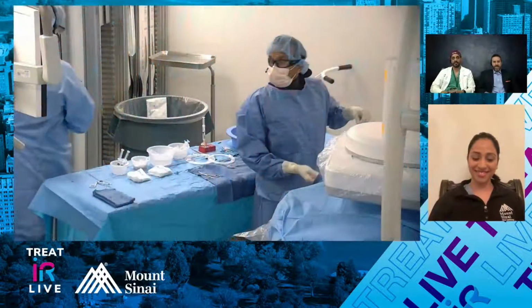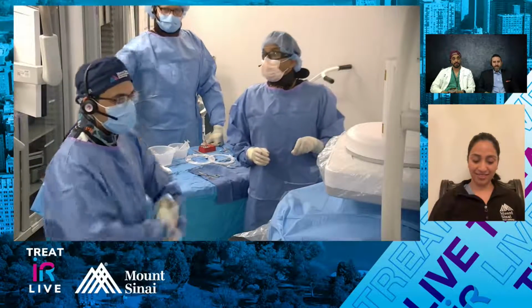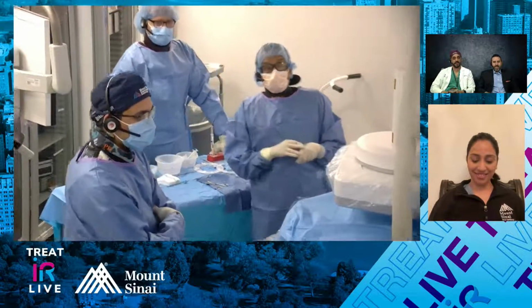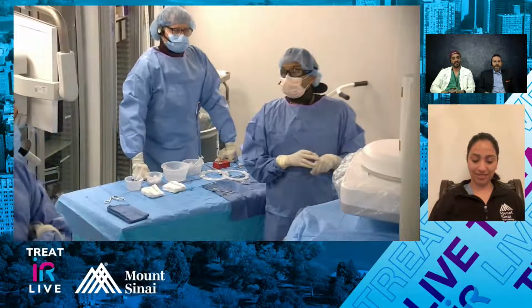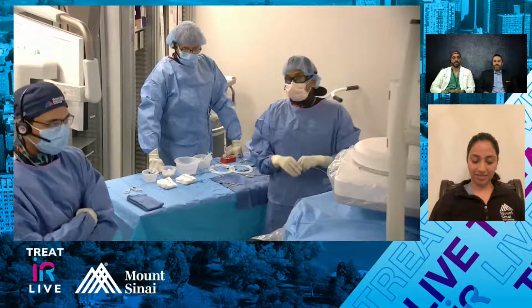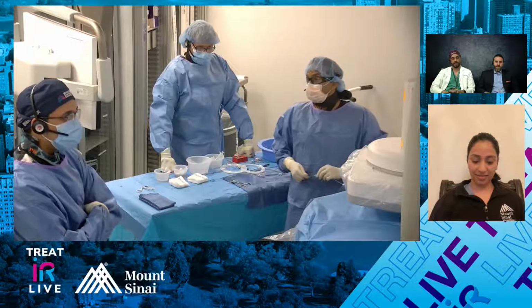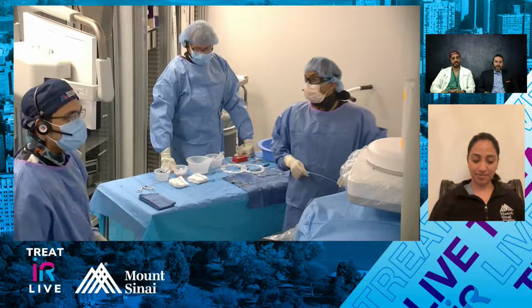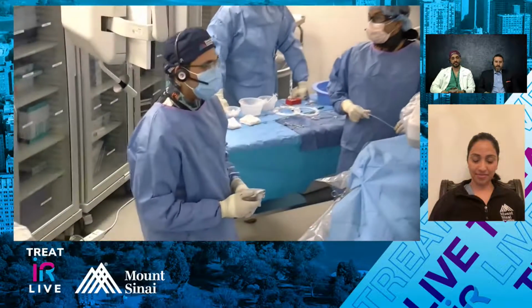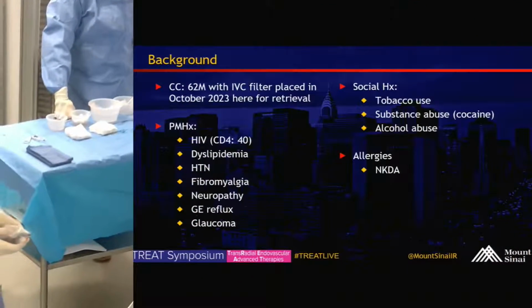So again, back to Scott and Raj. If we can show them. I think they're furiously working. So there's Dr. Nowakowski, the other Dr. Patel, and Dr. Rana, who's sort of hiding there in the corner. And so actually, while Raj and Scott keep the case going, Puneet, you want to introduce the case? Yeah, definitely. Let me just grab that slide for us.